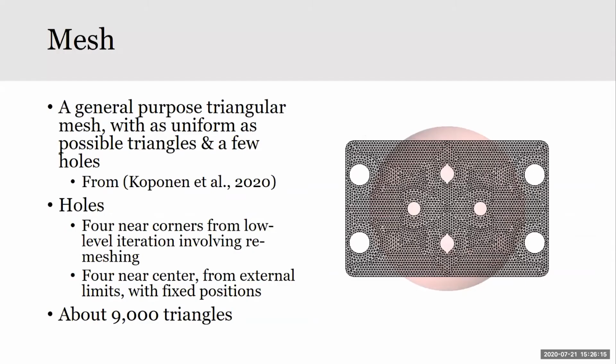So our meshes are as with previous, except that our holes, in my case, move around with the optimization. So their location is not fixed in the beginning, but the location is defined by the coil properties. But that just adds one more step to the optimization.